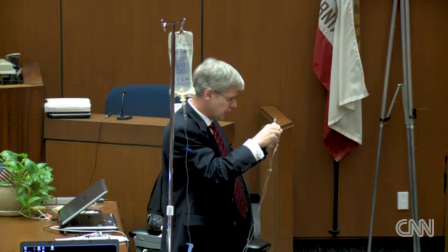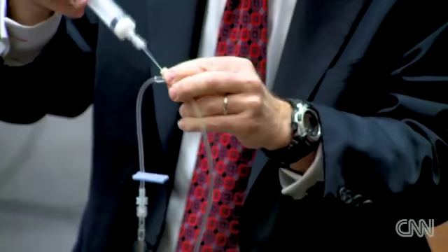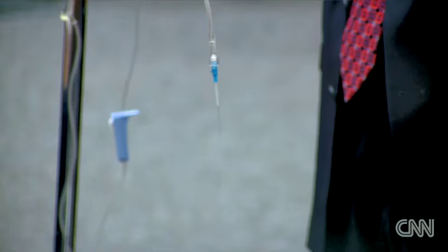Dr. Murray, in his interview, described that he clamped the infusion line first, as I have done here, and said he slowly gave this over three to five minutes. I'm going to do it just a little bit faster, not too much faster. The propofol is now going down the tubing. What you see is that it's all in the tube — none of it reaches the patient.